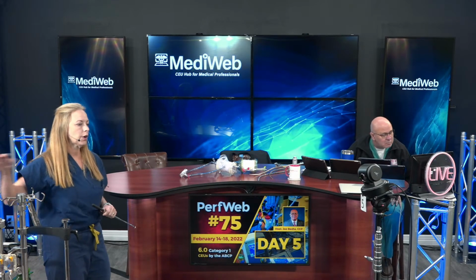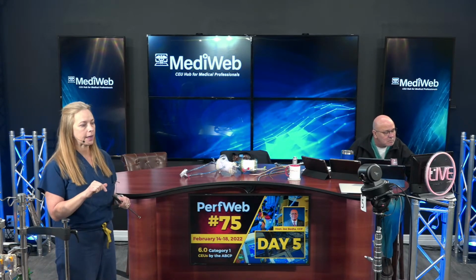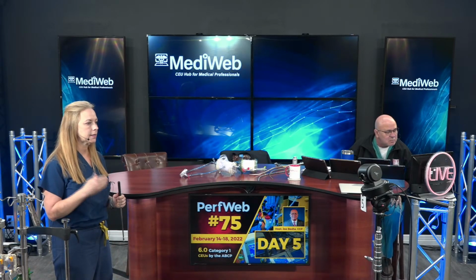So if you're at 4 liters, maybe it's just dipping down to 3.5 and going back up to 4. It's not always going to be immediate and dramatic.